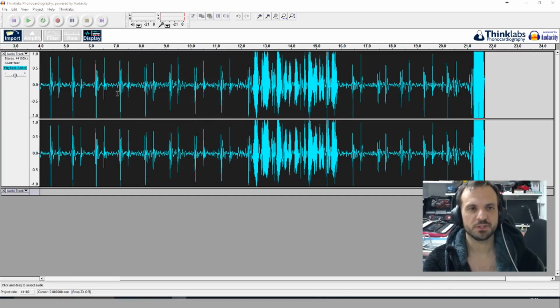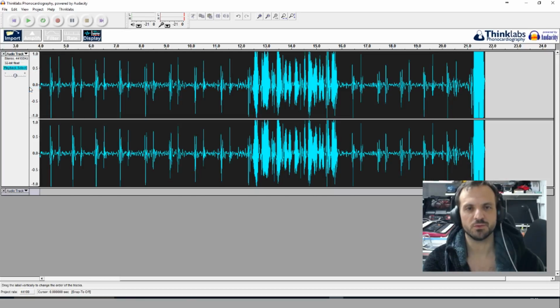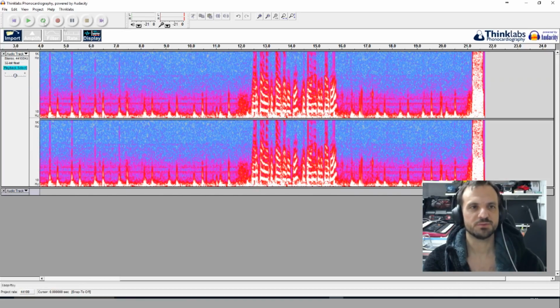And then what I'm going to do now is we can actually change it to a spectrum rather than a waveform, and it'll look more hospitalified. There you go. Doesn't that look quite hospitally? Indeed it does. So there you can see the heartbeats here. So you can see there's two.